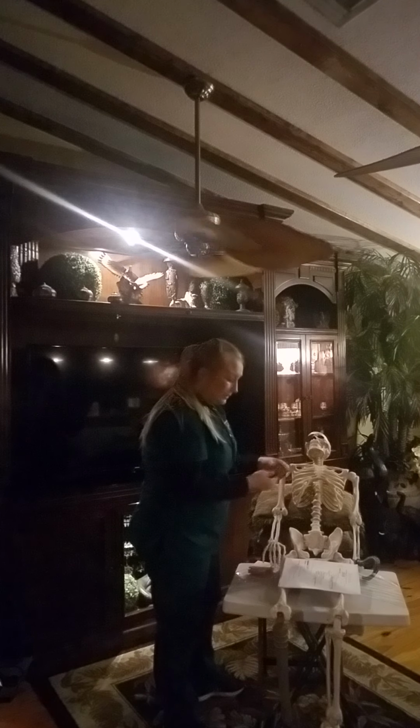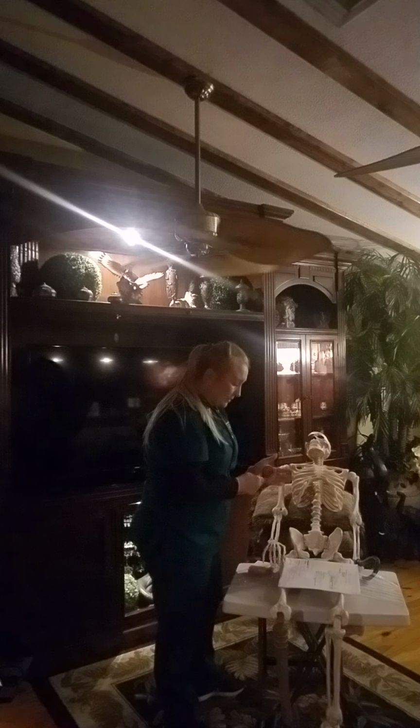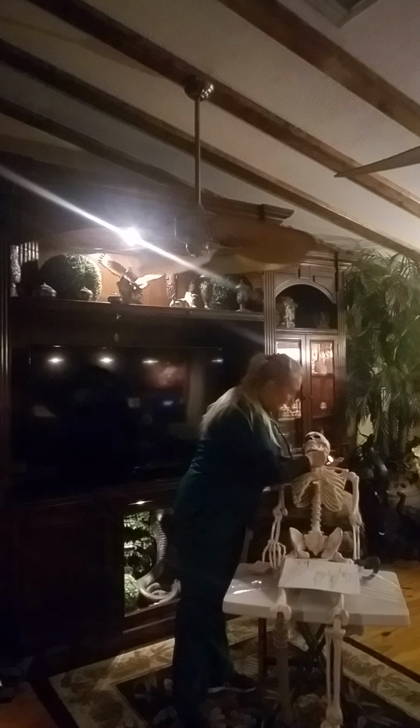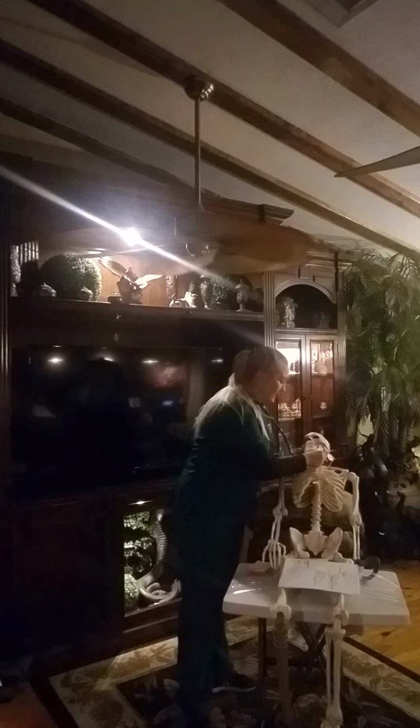First, I can use the bell to listen to the carotid artery. I'm going to be placing it on the side of the neck, and here we're listening for bruits, which could be a sign of turbulent blood flow through the carotid artery.